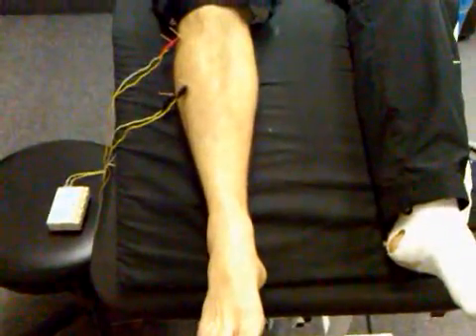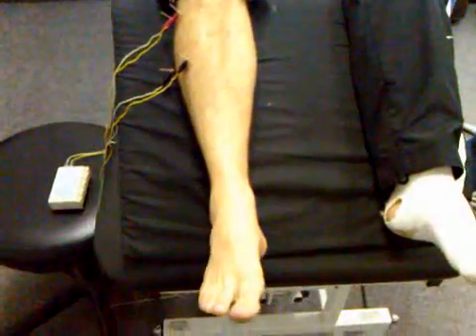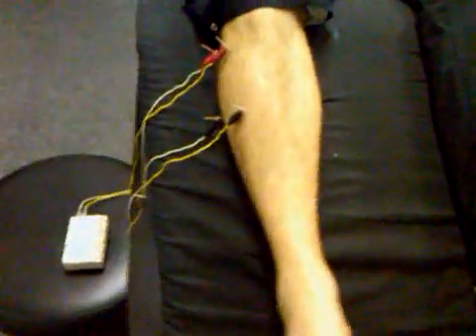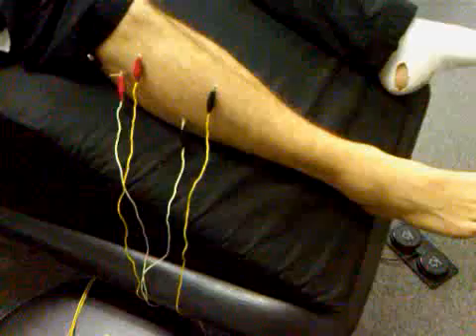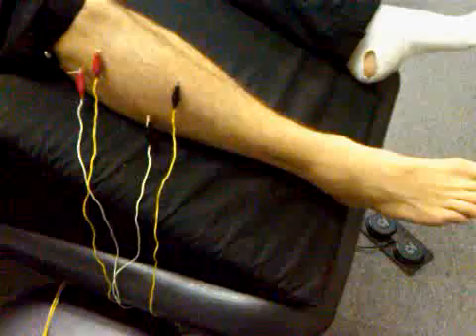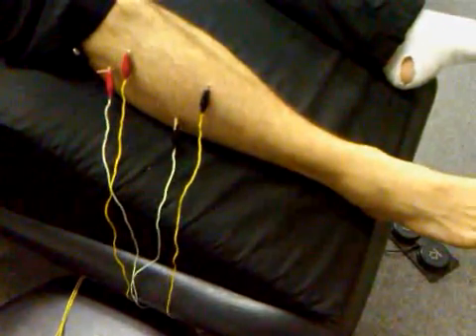This creates what we call the sling of the ankle, otherwise known as the ankle tape job. After we've excited the motor neuron pool, we can have the patient do his proprioceptive exercises in hopes of generating a more efficient and effective outgoing motor program to regain the lateral stability lost from his several lateral ankle inversion sprains.